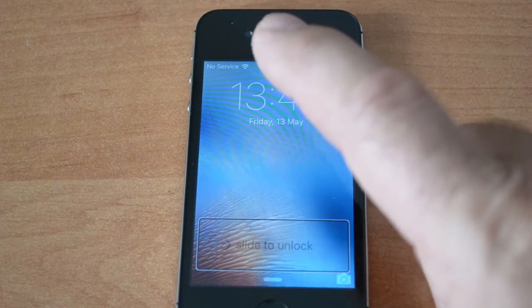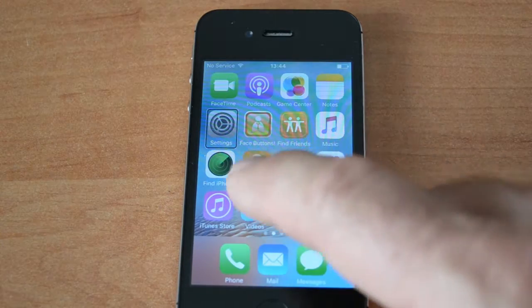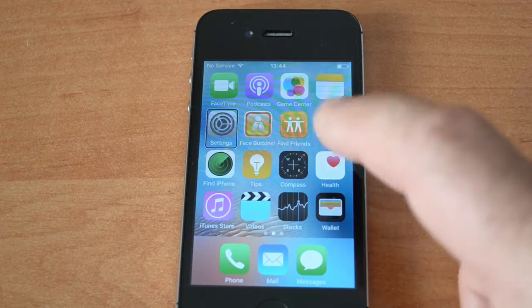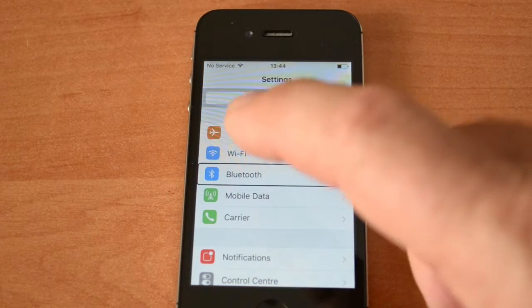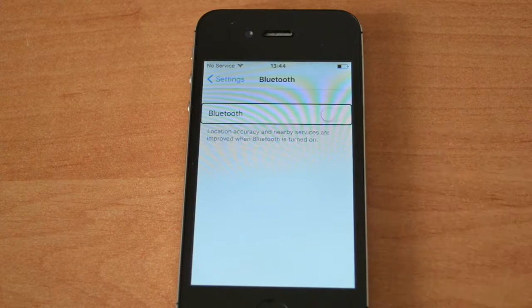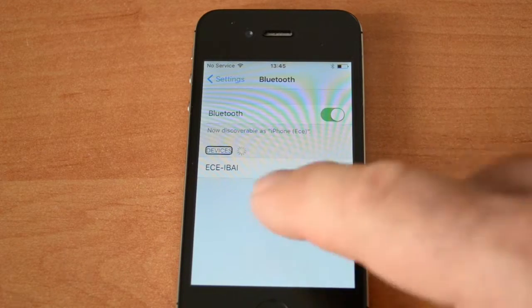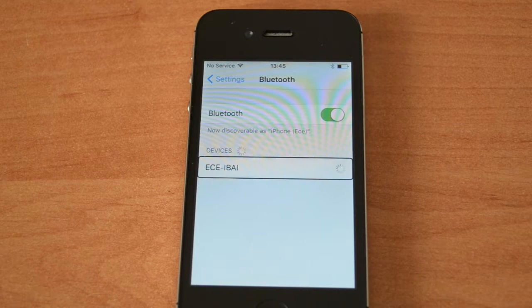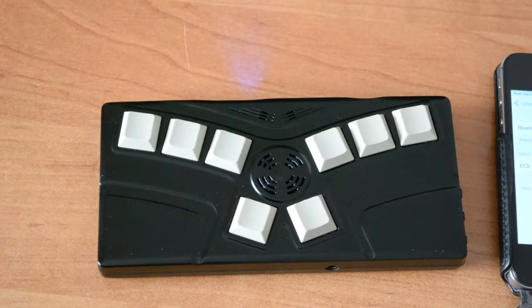So we will go to our iPhone settings. I will go to settings and then to Bluetooth, and I will switch on the Bluetooth. Okay, it has found IBAI, so I will go to IBAI and start the connection. Now it's similar to the other devices. I don't have to do anything with the iPhone. Now I will get the message from the IBAI.